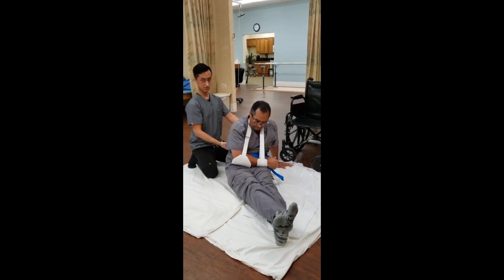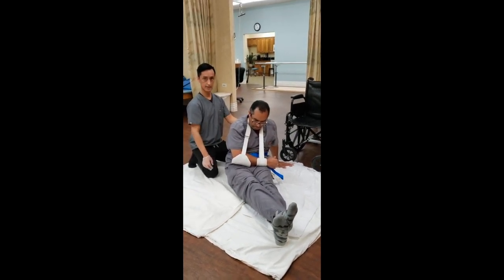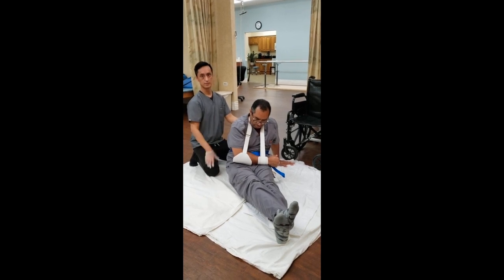Now from here you can have the patient lay down, do exercises in the mat, whatever you have to do with the patient. Pretty much it.